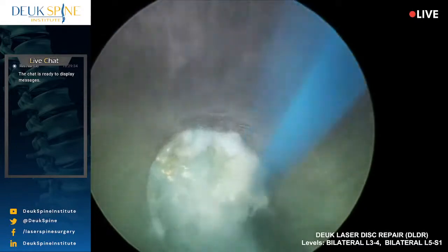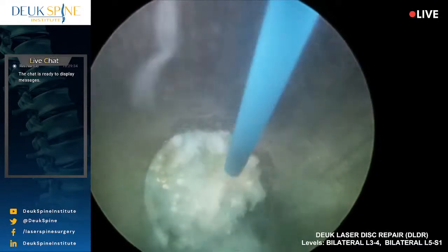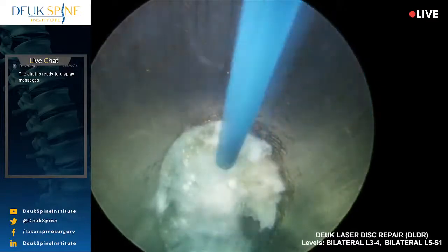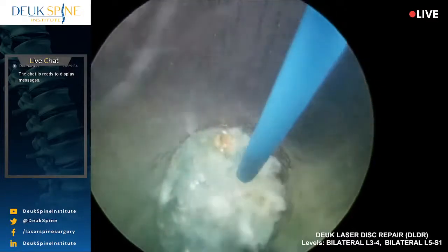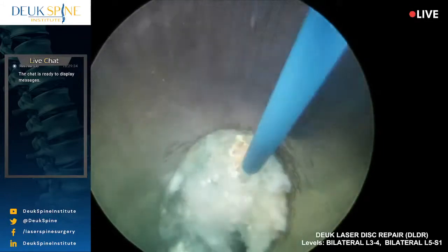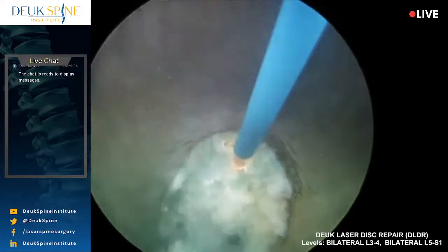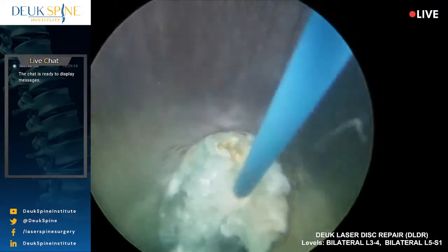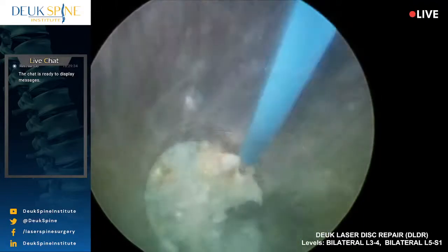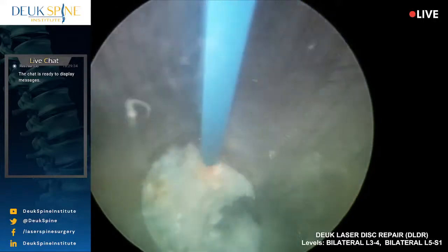So that's why it's looked down upon to do Depo-Medrol through a needle. Now we use Depo-Medrol here, but we do it through the scope topically. So it's really topical rather than an injection. But that's what this stuff looks like to me. It looks like Depo-Medrol, because Depo-Medrol has particulate matter in it. It's a preservative, and it looks white.